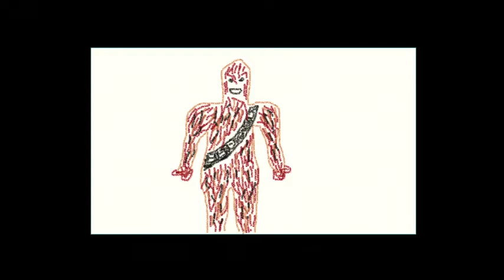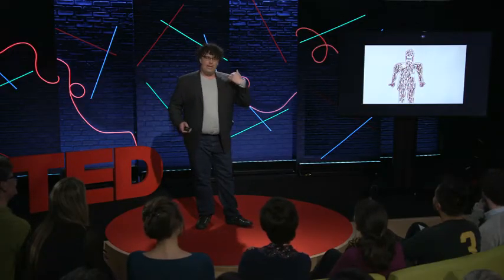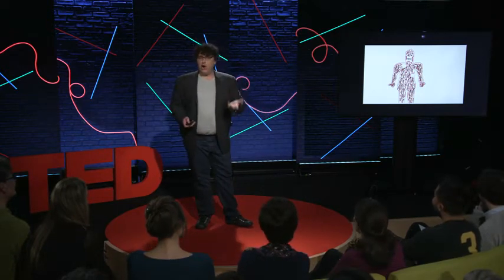Wookiees also have another problem. They have an accessory issue. So what we want to do is remove these. Anything between the two pads we want to remove, since it can cause something called arcing.